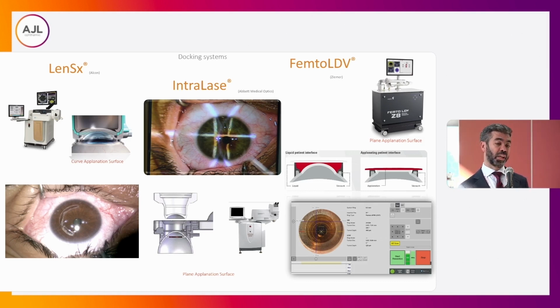After that, you'll be able to implant the intracorneal ring, and with all of them it's the same. Usually you don't need to use any instruments to introduce the segment. And as a good tip, you will need to move a little bit forward from the incision because it can move a little bit. If I have a progressive keratoconus, I also perform cross-linking, so that's why you'll see that I'm taking out the epithelium.